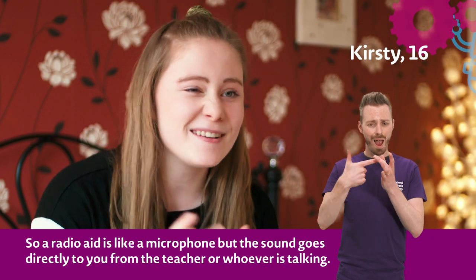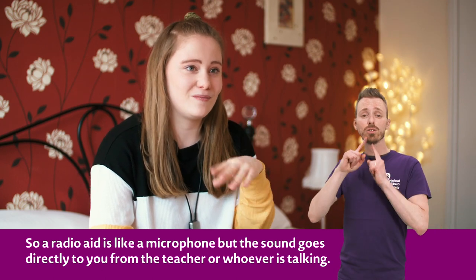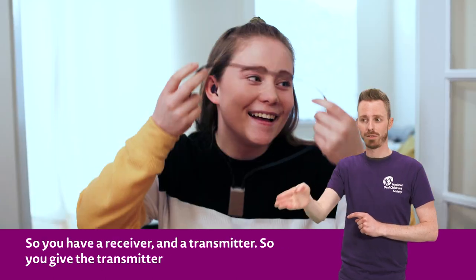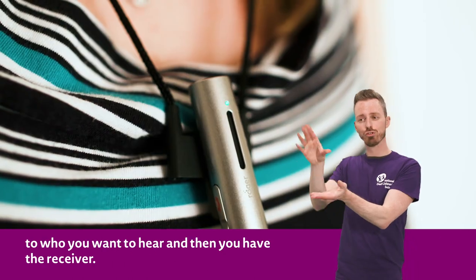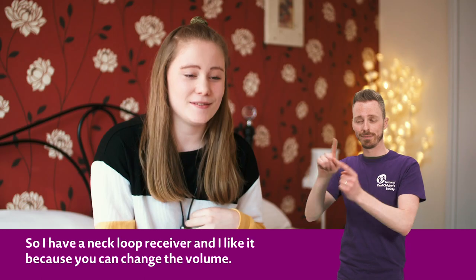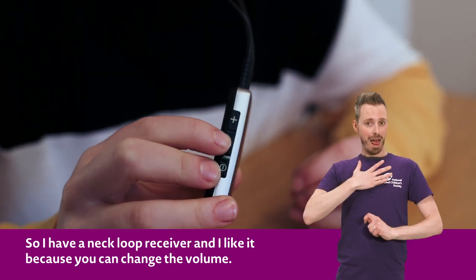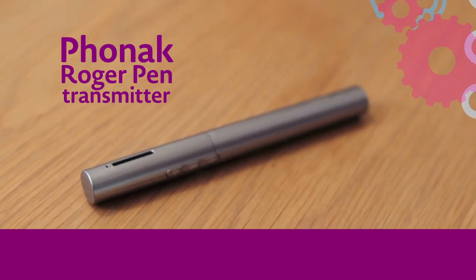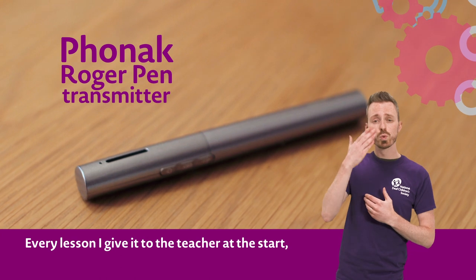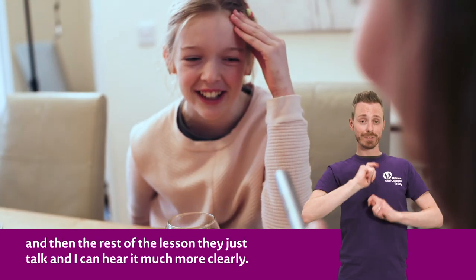A radio aid is like a microphone but the sound goes directly to you from the teacher or whoever's talking. You have a receiver and a transmitter — you give the transmitter to whoever you want to hear, and you have the receiver. I have a neck loop receiver and I like it because you can change the volume. Every lesson I give it to the teacher at the start and then the rest of the lesson they just talk and I can hear it much more clearly.